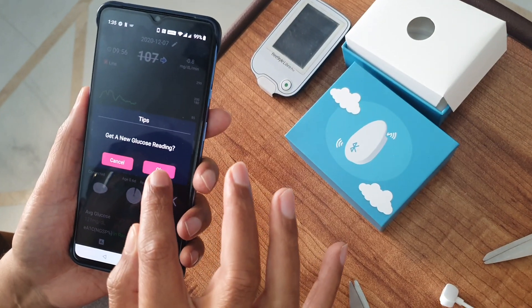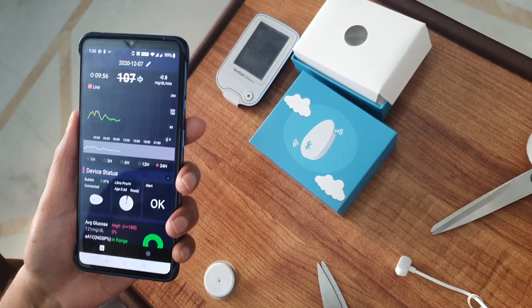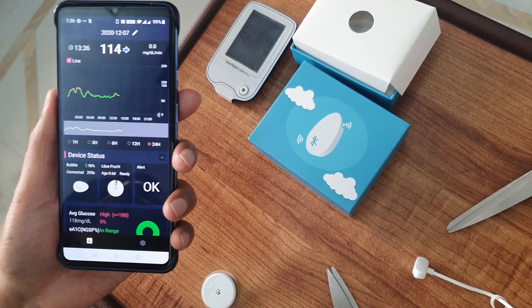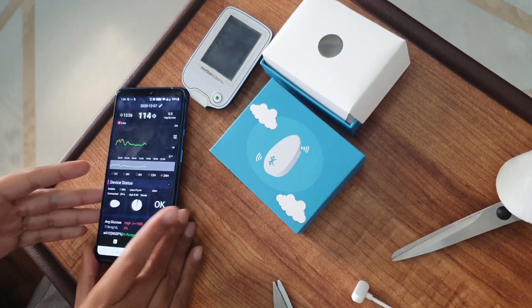We can click on 'Get a New Glucose Reading.' As you can see, we got a new reading and this is working perfectly fine.